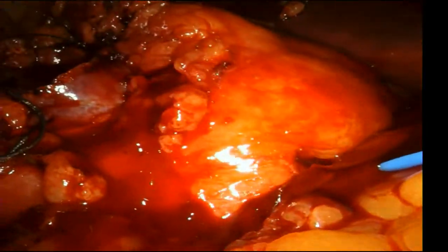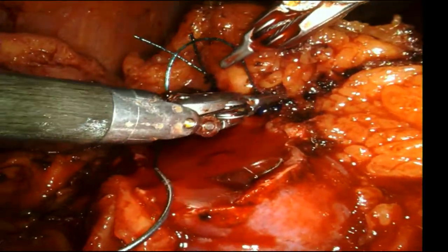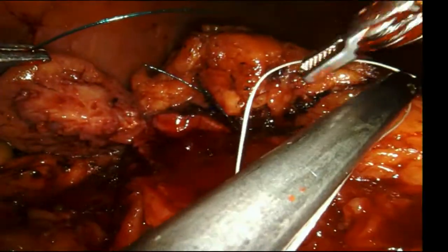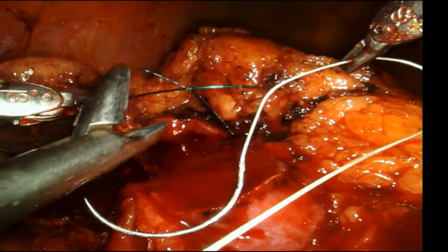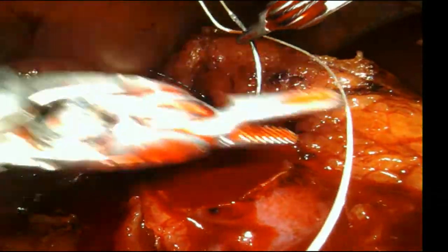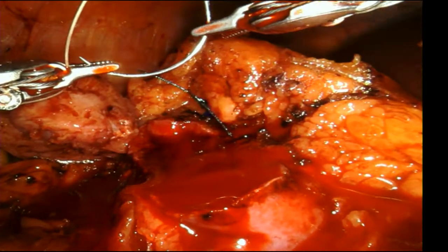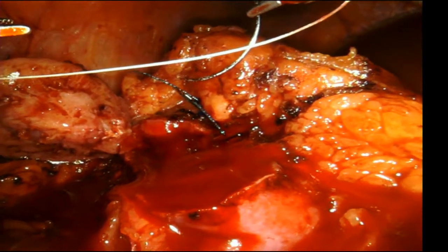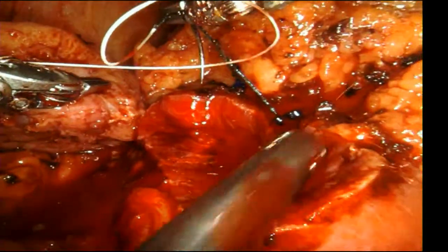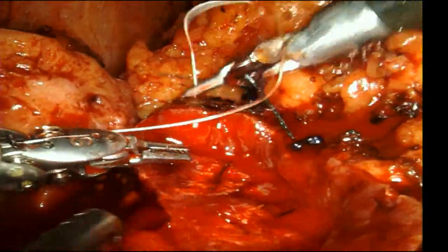Okay, mark the time. Let's have the 3-0 now. Thank you. Okay, suction. We'll get it later. So we had 7 minutes and 17 seconds, Kelly tells me. So I don't think any need for mannitol or anything.